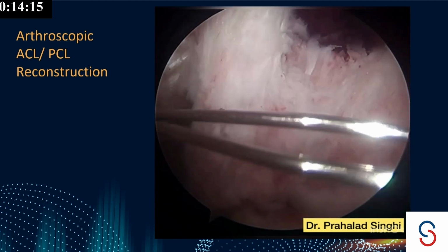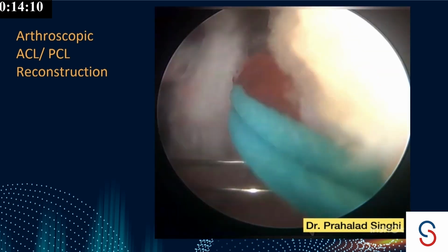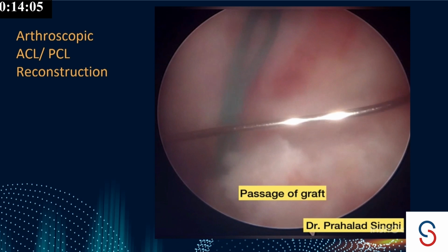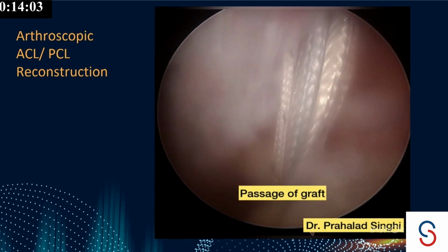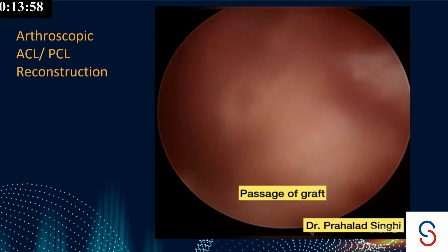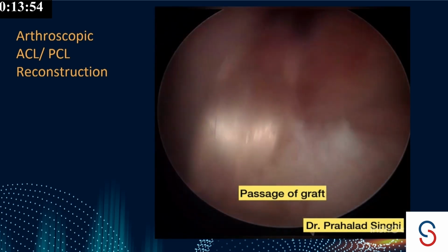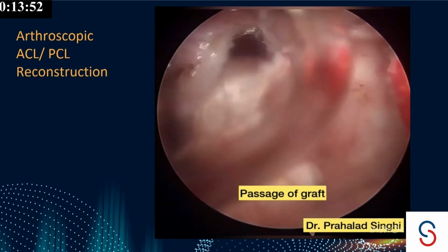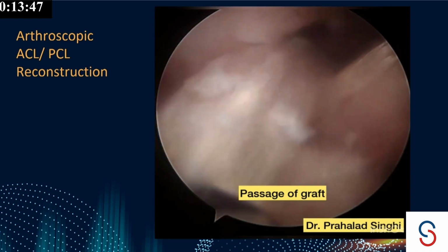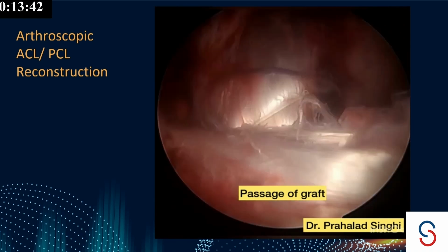So now there are so many techniques which have been developed to avoid these kinds of issues. 2 years ago, we all were using the switching stick or the Wissinger rod to guide the graft into the tunnels. So I did the same technique here. I used suspensory fixation for both the sides, and this is the nice robust PCL graft which is coming, and this is the ACL graft which has come in, and then you can see that they were good.